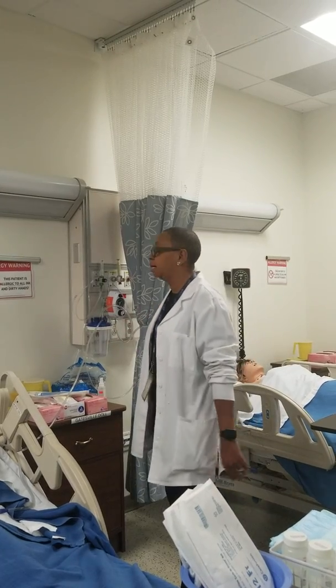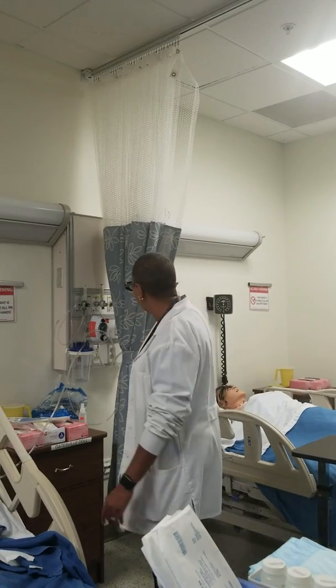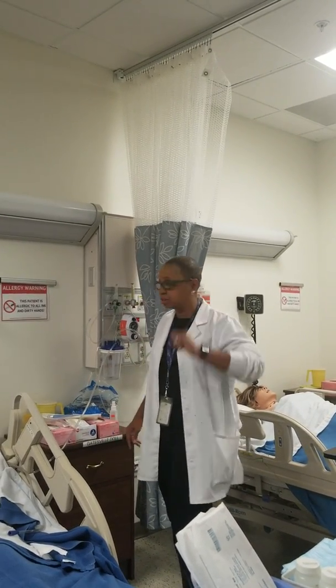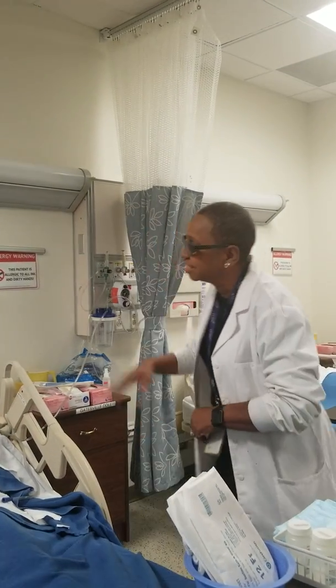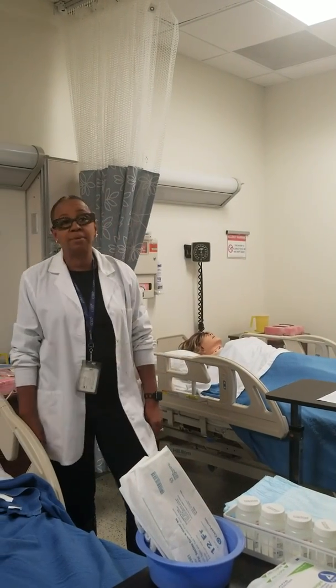Okay, lift the patient up. So just because I have suction set up doesn't mean it works, right? So I always assume nothing works. If you do that in nursing, you'll be okay, all right? Just assume you need to check it. So when you come in and you start assessing, like I said, you start assessing that patient from the door. Okay, when I walk in, I'm assessing you from the door.